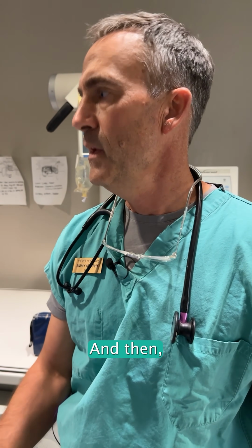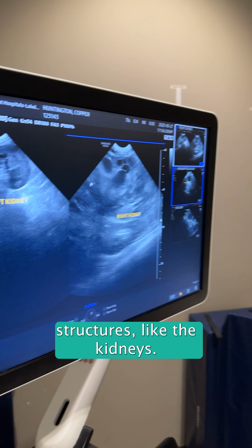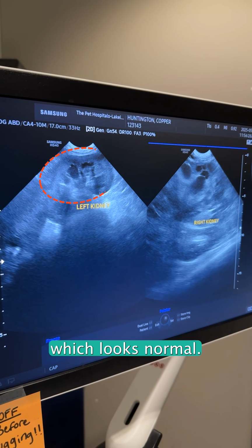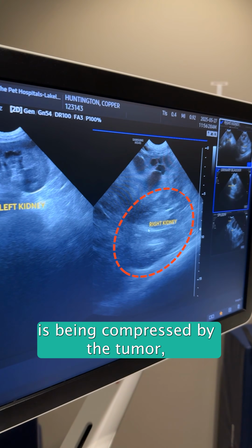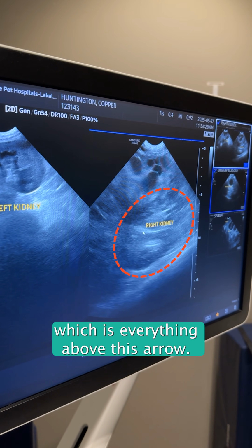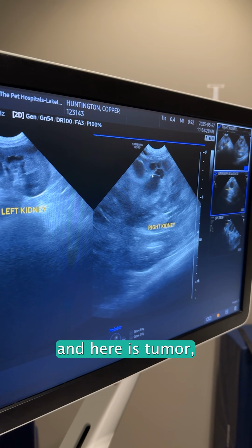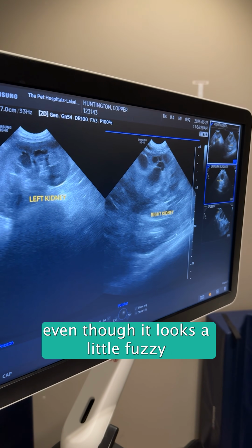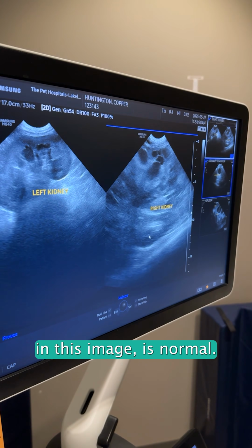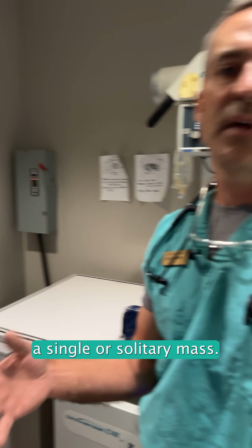And then we look at other structures like the kidneys, and here's an example of the left kidney, which looks normal. The right kidney in this view is being compressed by the tumor, which is everything above this arrow. Everything between here and here is tumor. The actual kidney itself, even though it looks a little fuzzy in this image, is normal. And so we think this is what we would call a single or solitary mass.